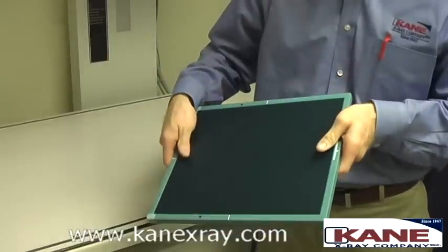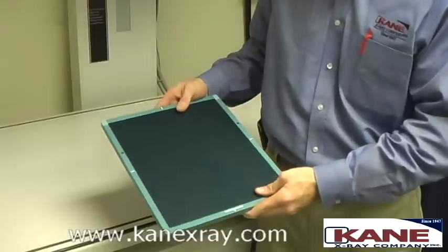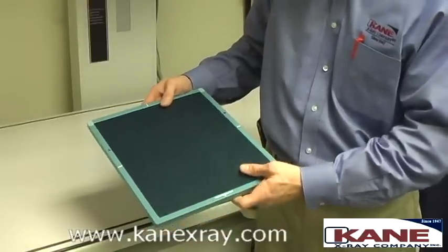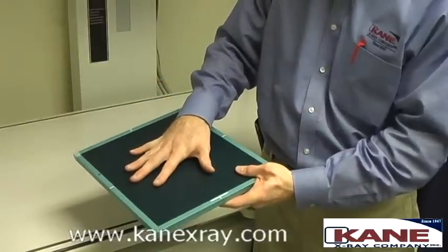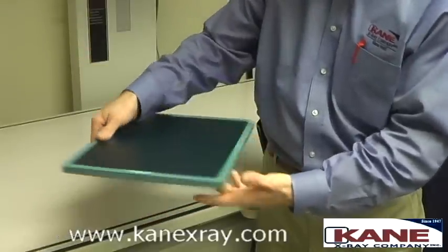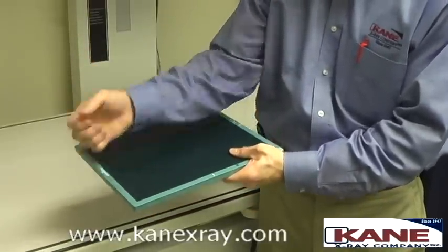For cassette selection, we want to use the smallest cassette size necessary for the anatomy that we're most interested in. So for example, if we were doing a small extremity, the 10 by 12 or the 8 by 10 would be fine. If we're doing a larger extremity, we might need to grab a 14 by 17 size cassette.